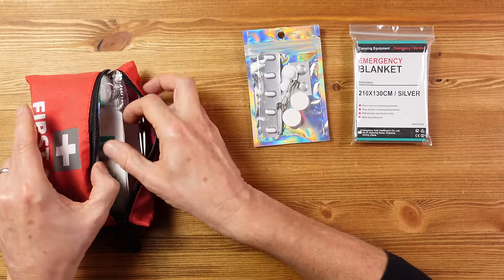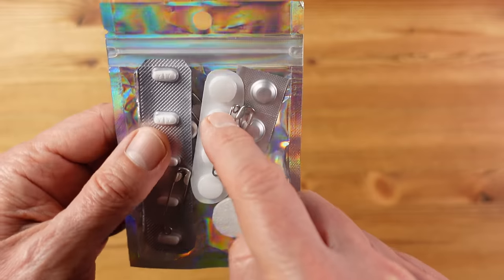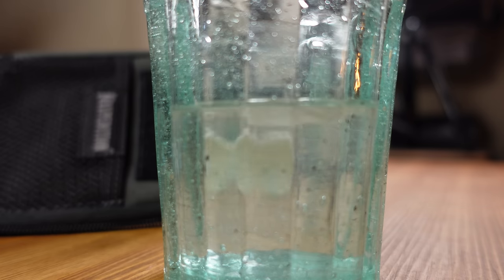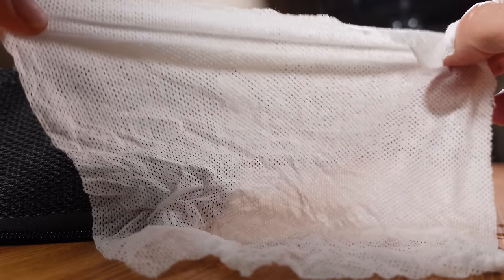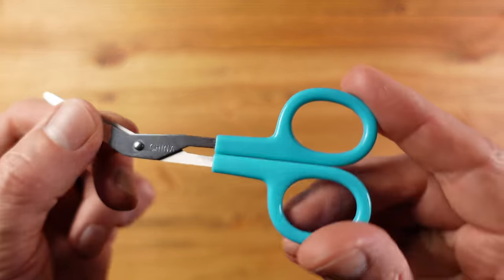Let's see what else we have. I've got some dressings — a bit smaller than in the trauma kit, for smaller cuts and grazes — and a conforming bandage to apply these, with some safety pins to help attach it. In here you'll also notice these large white tablet-looking things are actually compressible towels: apply a bit of water and they expand into a very useful moist cleaning cloth. Also in here there are some pretty cheap scissors — bearing in mind this kit might be used independently of the trauma kit, it's worth having something to cut away clothing if needed.